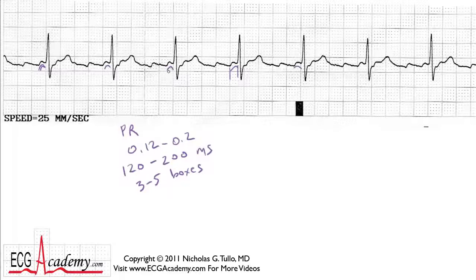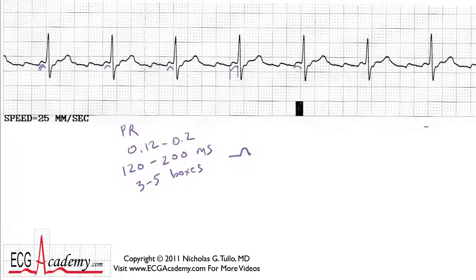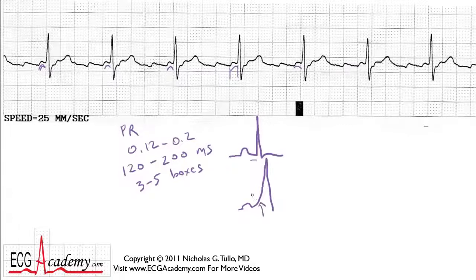So you'd have to call this sinus rhythm with a short PR interval. When you think of short PR intervals, there are a couple of syndromes that come to mind, like WPW syndrome, where instead of having a PR segment that's fairly flat, what you have is a delta wave — a slurred upstroke of the QRS complex and a very short PR. But that's not really what we're seeing here; we're seeing just a short PR interval.